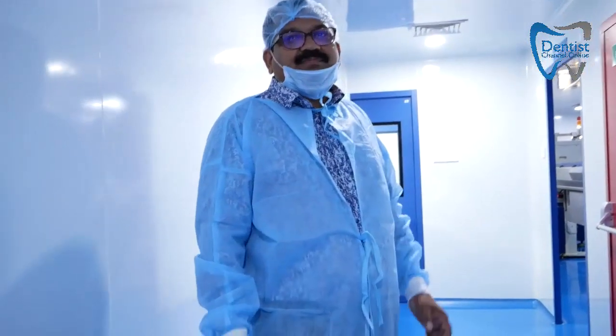Hello and welcome back to Dentist Channel. This is Rose Bell Fernandes and today we are going to take you to an implant manufacturing company. We're going to show you how the implant is being manufactured and what are the steps taken for quality management. The first stage of production is the machining of titanium rods, so we are going to the machining room.